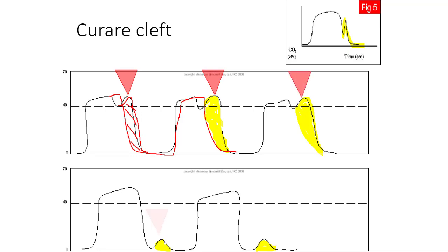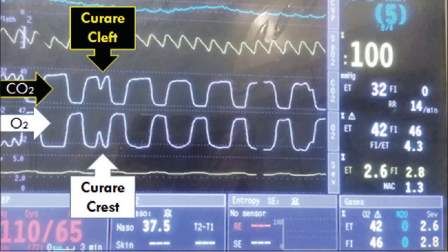There's examples of the cleft. Here's a real actual incident. So I'm going to see if I can change my pen again here. Actually, I want to do my laser pointer. Here's a bump. Now I want to point out something. So what you see here, there aren't a lot of pre-hospital monitors that do that. The new Zoll, they have an option for this, airflow monitoring, which I think is actually pretty damn cool. But you aren't seeing this a lot in the pre-hospital setting, but you will see this in the ORs. You will see this in critical care.